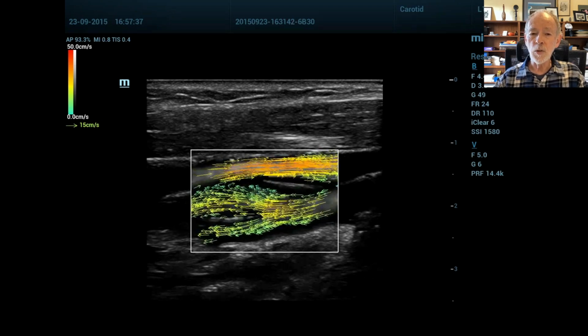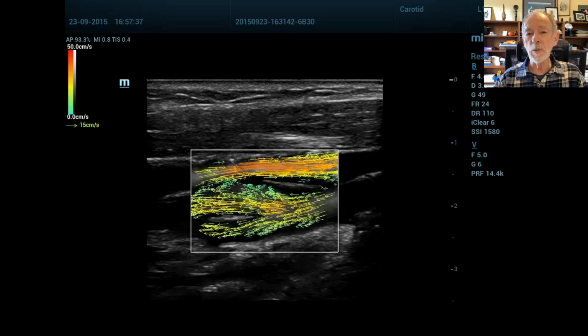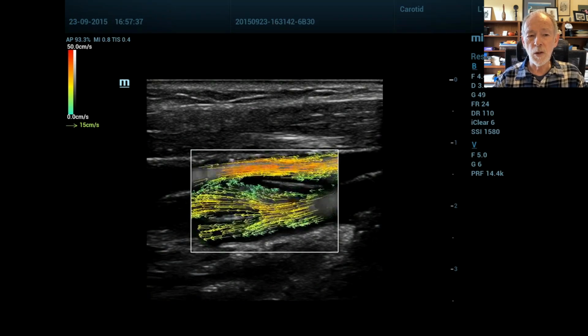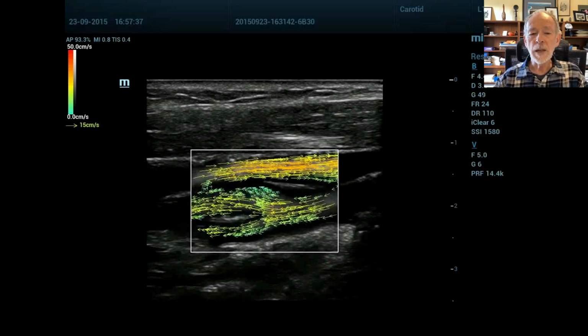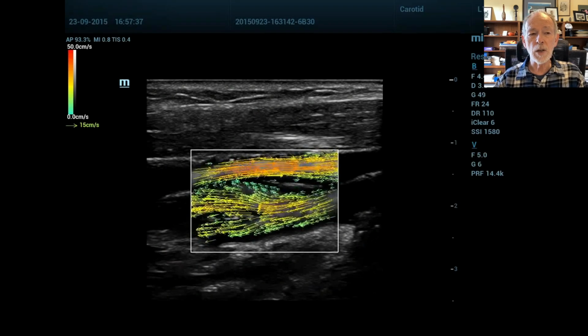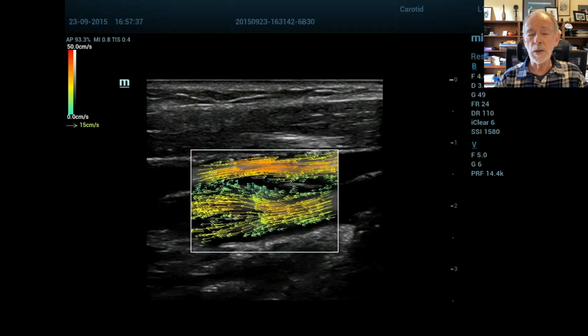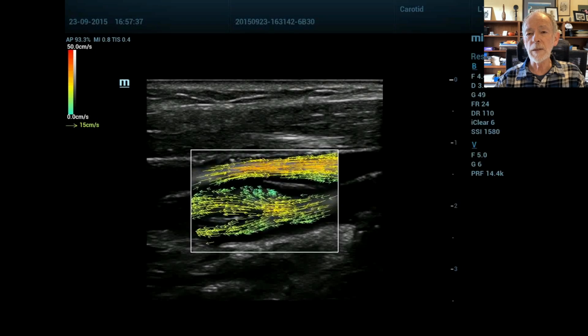The arrows show you the speed and direction of motion of the blood at different points. This is referred to as vector flow imaging, vector velocity imaging. And you can see, on the top left, if we look at the color bar, that we have absolute velocities because this is not a Doppler-based technique. This is using speckle tracking.